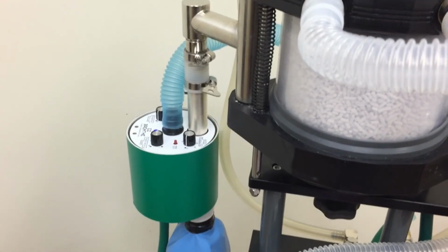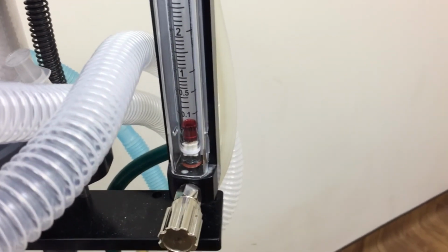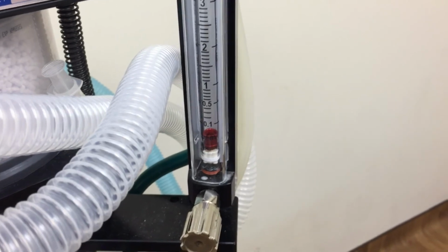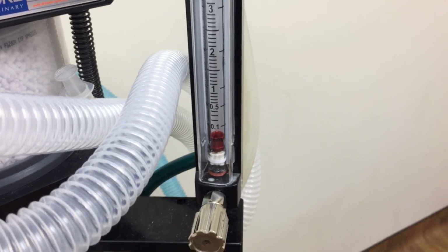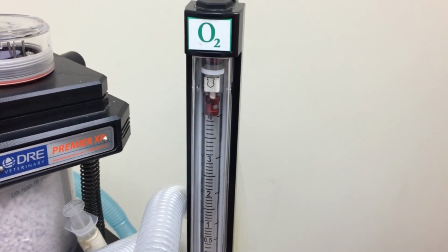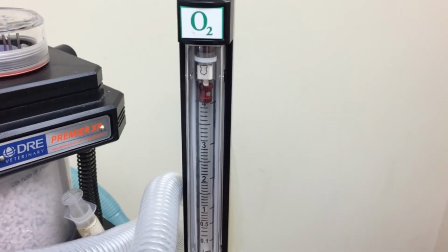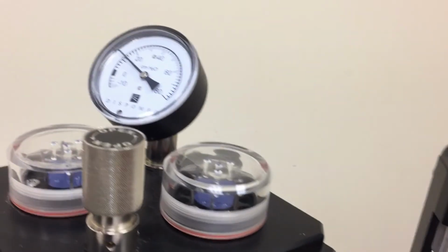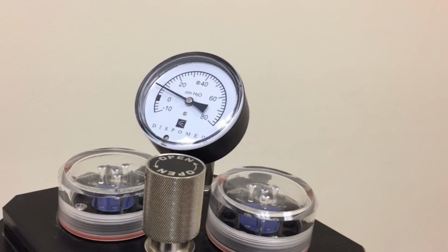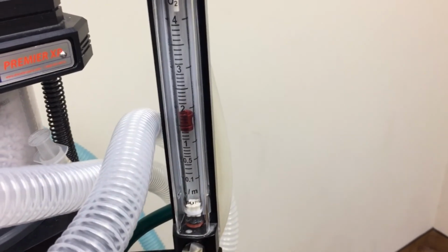Another cause of the low pressure disconnect alarm might be that the flow meter has been turned off, or that it was never turned on to begin with, or that you've run out of oxygen. The solution for this is simply to turn the flow meter back up to a higher flow, perhaps 4 liters a minute, or even higher with a large bag, and wait till the pressure starts to come up. And once it has, simply bring the flow back to the 1.5 liters a minute.